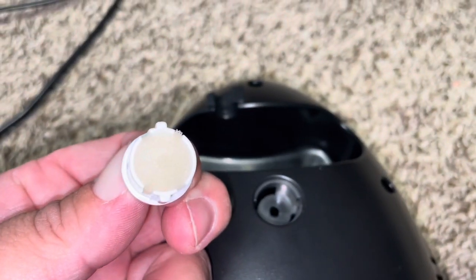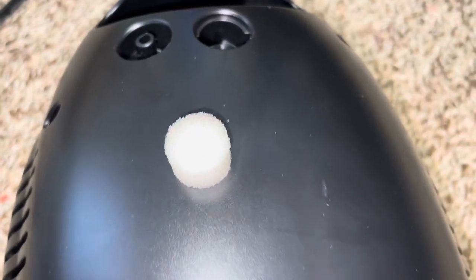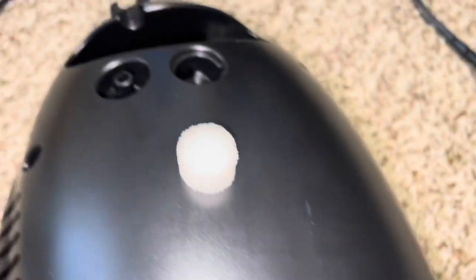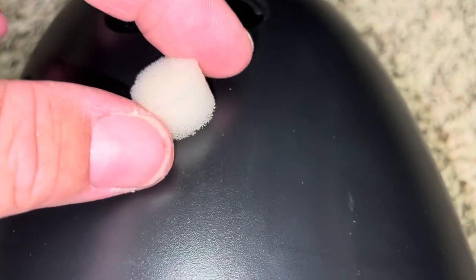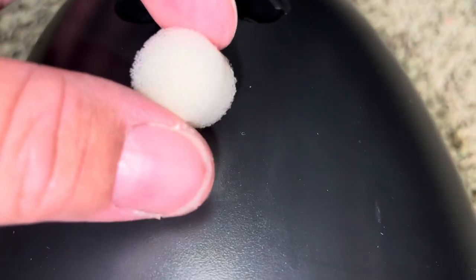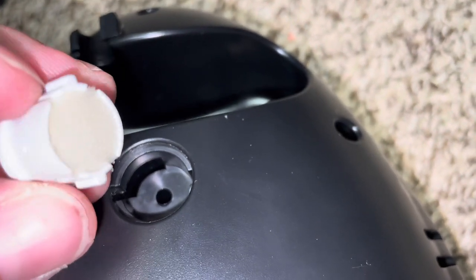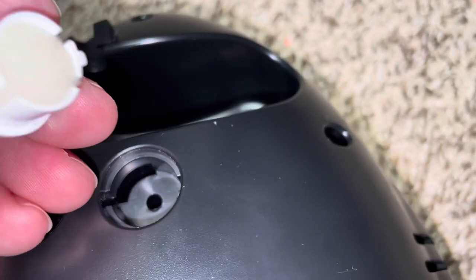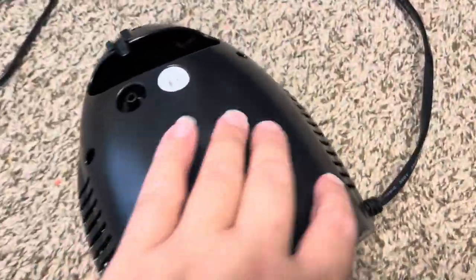You just kind of turn it and take it out. Do you see how little this is? It is so tiny — just like the size of the tip of my finger. This nebulizer was in storage for a while, and I wanted to make sure my son had a brand new filter. These little things are hard to find locally, but you can get them online. The official name for them is replacement air filter sponges for nebulizer. You just twist it back in and hear a little click.